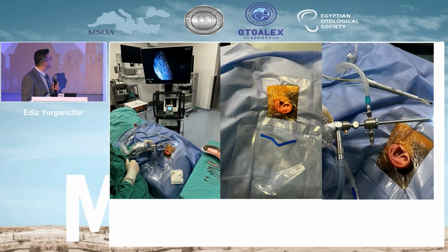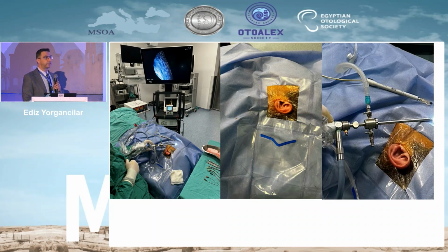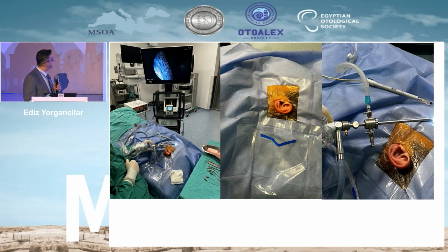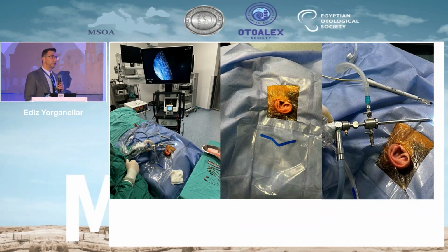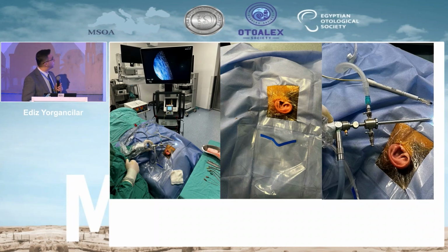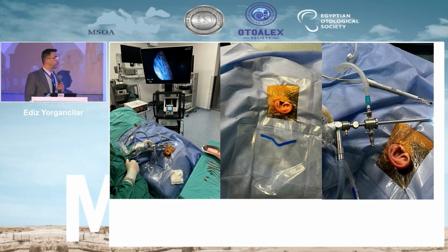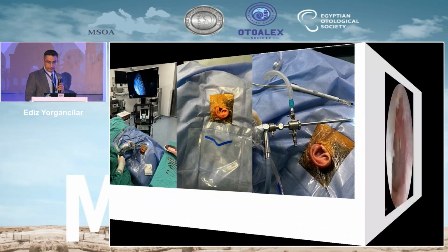As you can see here, the sheath and the endoscope. The sheath connects to the saline perfusion with the Y-type irrigation system, and the saline solution overflows out through the concha and outside, and the suction helps us remove the excess saline from the field.